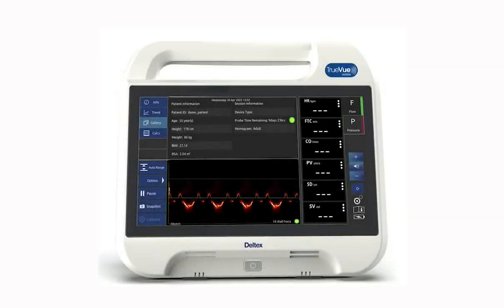The venous return signal shown here has a slower whooshing sound and appears below the baseline. This suggests the probe is positioned too low within the patient. Rotate the probe slightly and withdraw if necessary. No results are displayed on the screen.